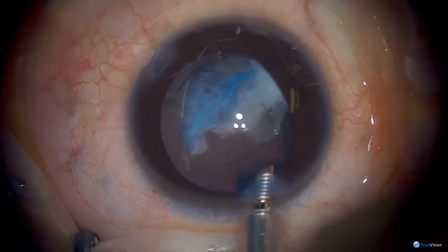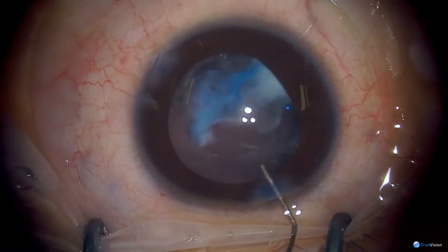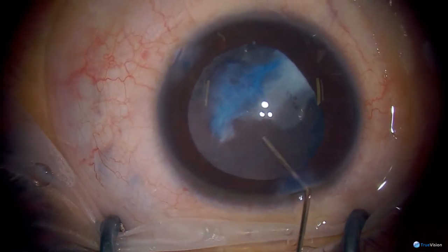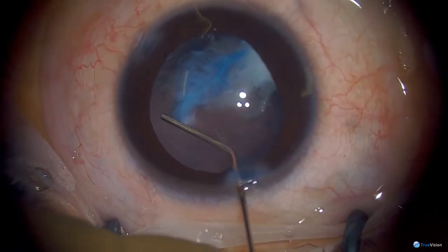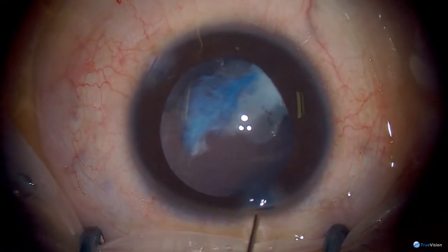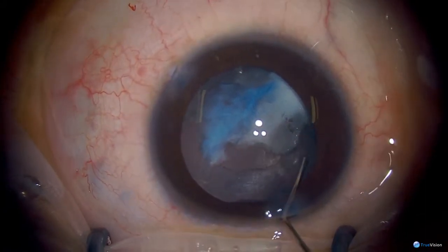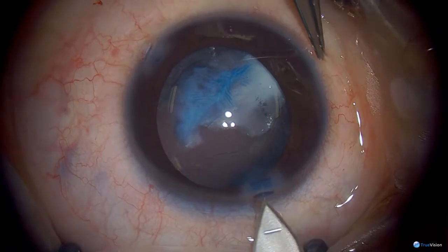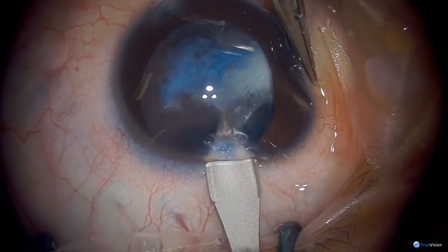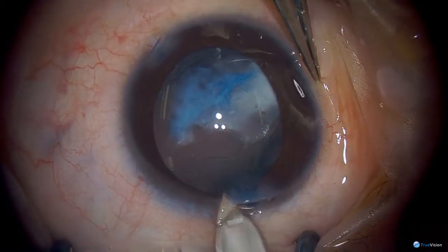We can turn off the infusion now. The advantage of doing this now is that because the posterior capsule is not open, it's easier to place the lens, and we'll put a little bit of viscoelastic in the sulcus. So if we're using a folding lens, it's easier if we just enlarge it a little bit more. So this is the 2.75 keratome.